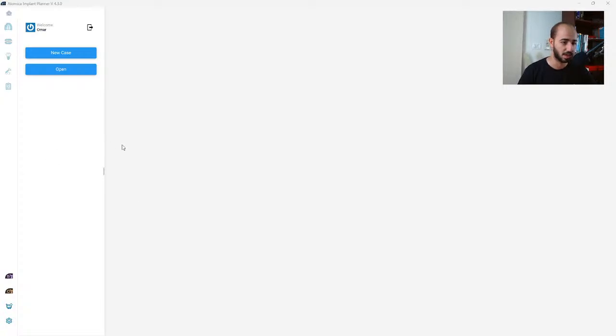So today, if you downloaded our software, this session will be able to assist you on how to utilize the software suite. And if you did not download the software, this will be a head start for you, and will assist you to learn more about Atomica.